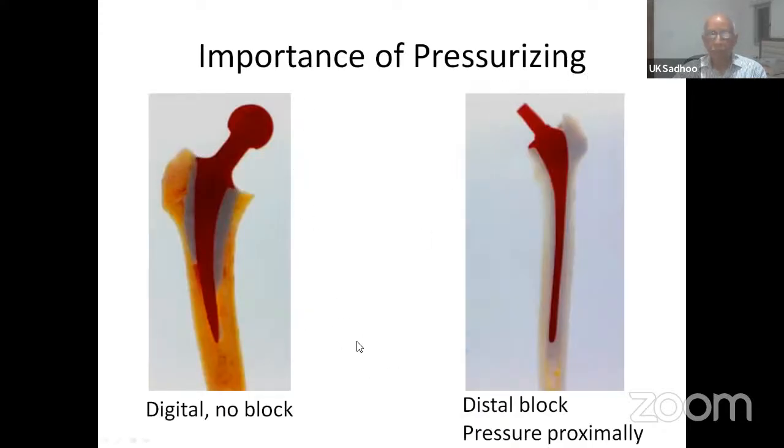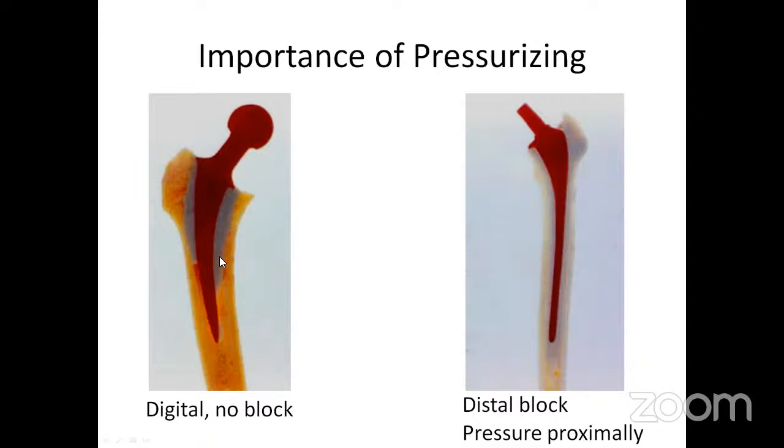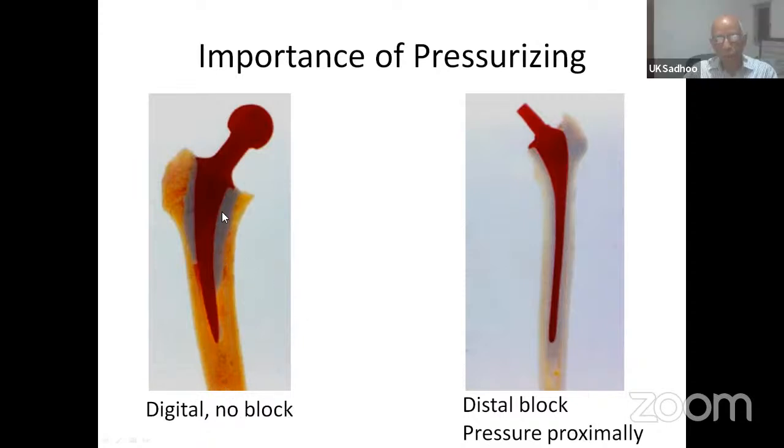What is the importance of pressurizing the cement? Look at this picture on the left side. This is a digital compression of the cement with no distal bone block. And look at the cement. It might look okay on the surface, but it has barely passed in adequate quantities beyond the proximal half of the stem. Whereas on this side, with the distal block and the proximal pressure, you see the uniformity of the cement all around, a uniform mantle into which a stem is put. That means a lot more surface area is available for dissipation of the forces of locomotion.